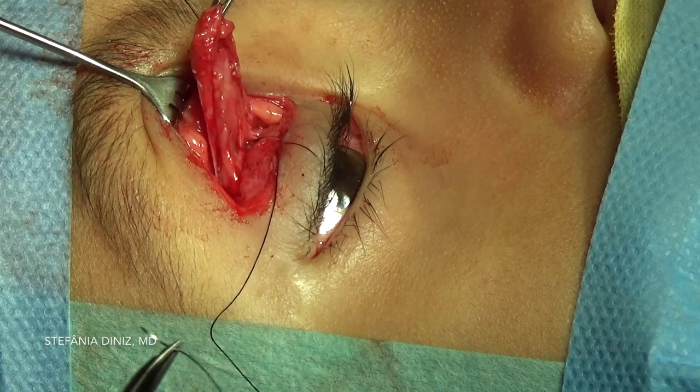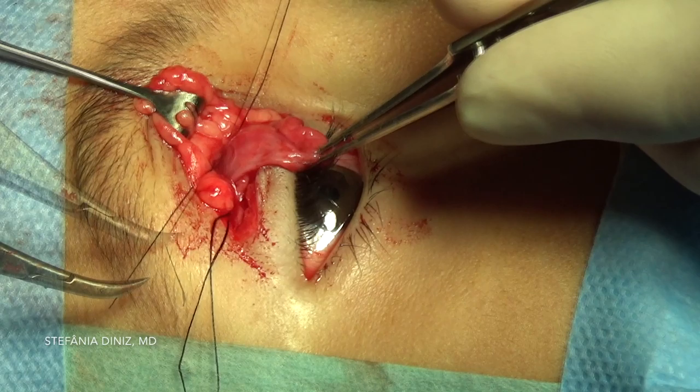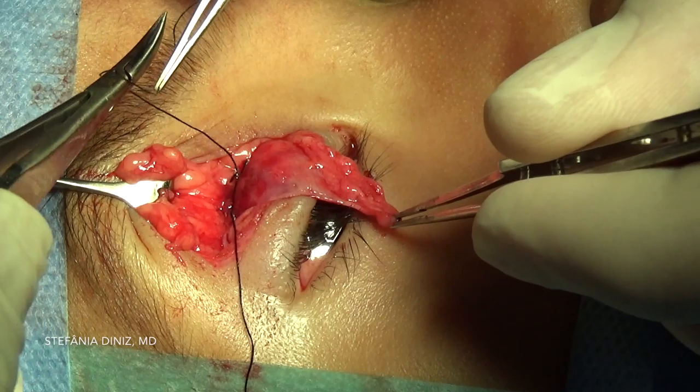The first suture is brought into place at the point of optimal lift, and an additional suture is then placed laterally for better height and contour. Sutures are then tied permanently.